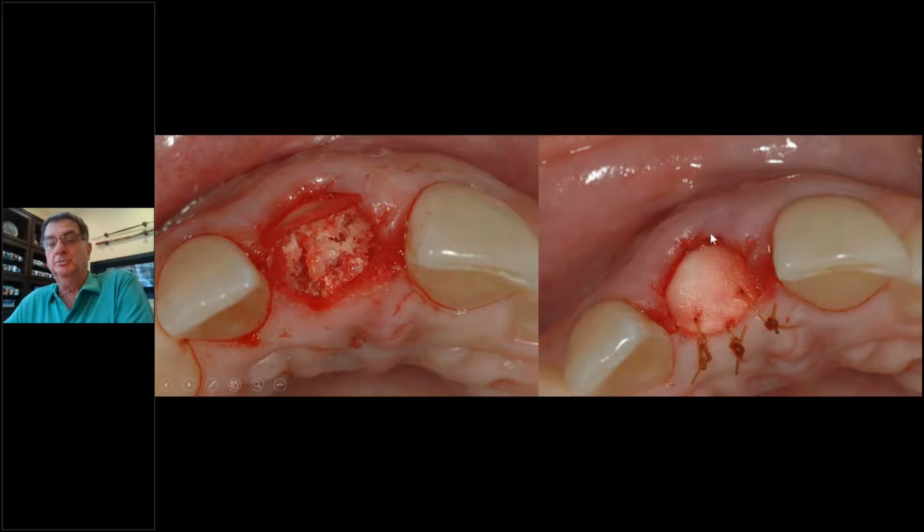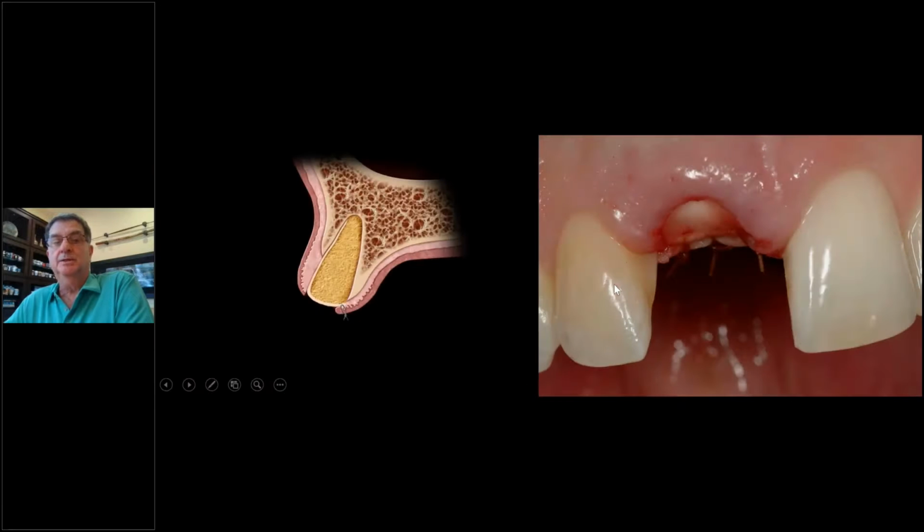The buccal doesn't even need anything to hold it in. It's held in by the pressure of the graft, and it's deep enough inside. You just suture the top if you flip it over, and that's it. This part's going to get destroyed in 2 weeks. It's a temporary protective canopy, and then it fills over by secondary intention. This is the part that's doing the work. The part that's covered stays there for a few months, and that's where your guided bone regeneration will take place. And this is what it looks like.